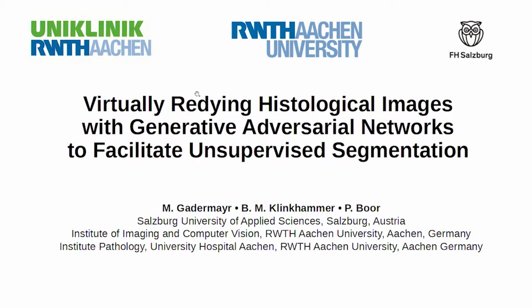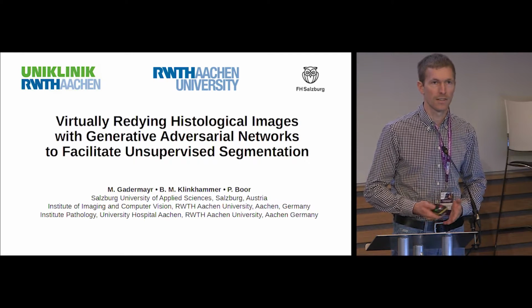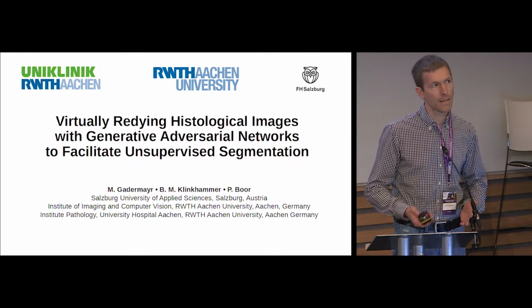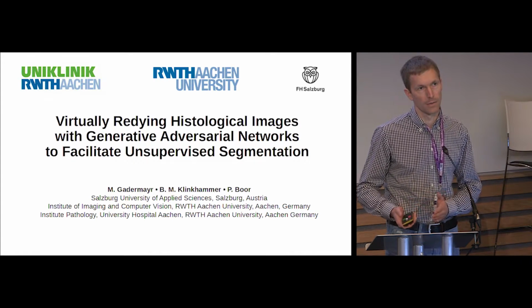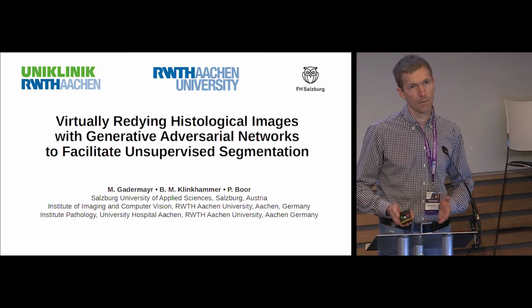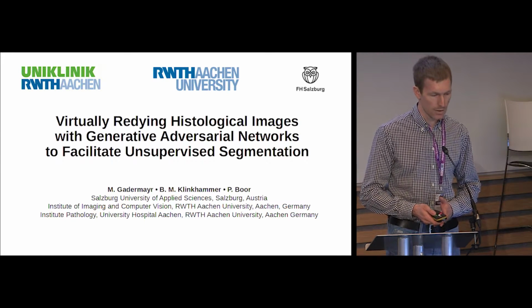Thanks for the introduction. First of all, I have to mention that from previous work we already learned that we are able to translate our kidney pathology images from one stain to another stain. And we used it for domain adaptation. So we wanted to segment an image for a stain where we don't have training data, but as we had training data for a different stain, we were able to translate from one domain to the other. And then we had the data, and so we were able to perform supervised segmentation.